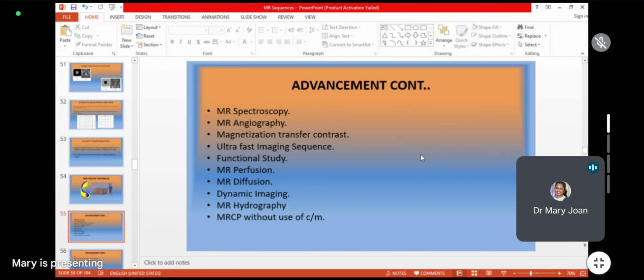Initially MRI was used for anatomical contrast. In CT, we may not be able to appreciate two similar tissues differently; the contrast and resolution among normal tissues, like different types of soft tissues, may not be that great in CT. There we need more contrast and resolution. So MRI came to aid for that. We can differentiate between two types of soft tissues better in an MRI image. So this was again anatomical or morphological imaging.